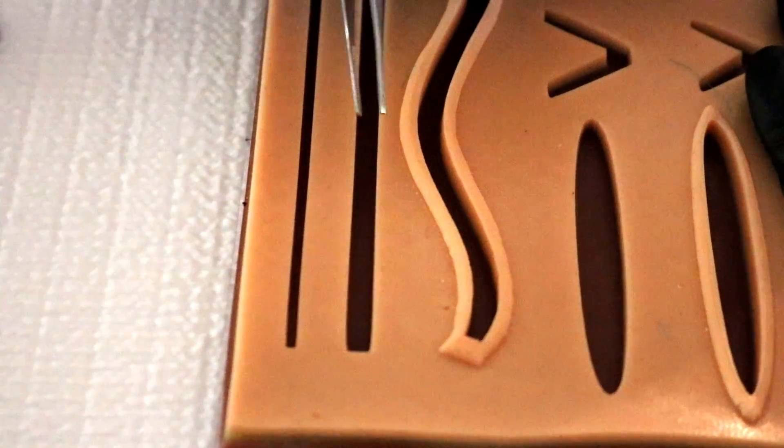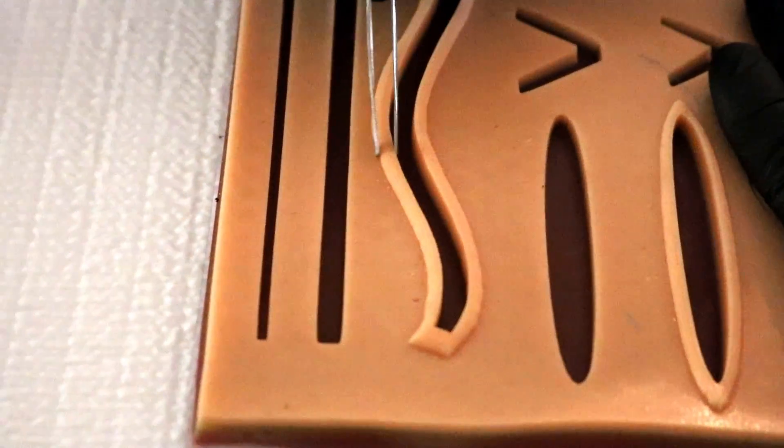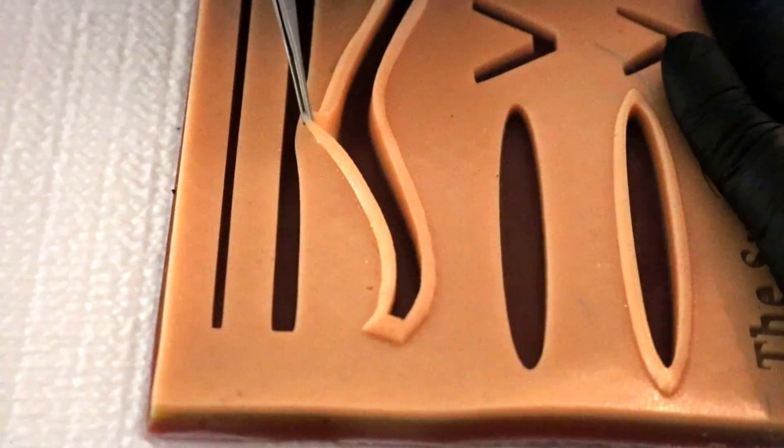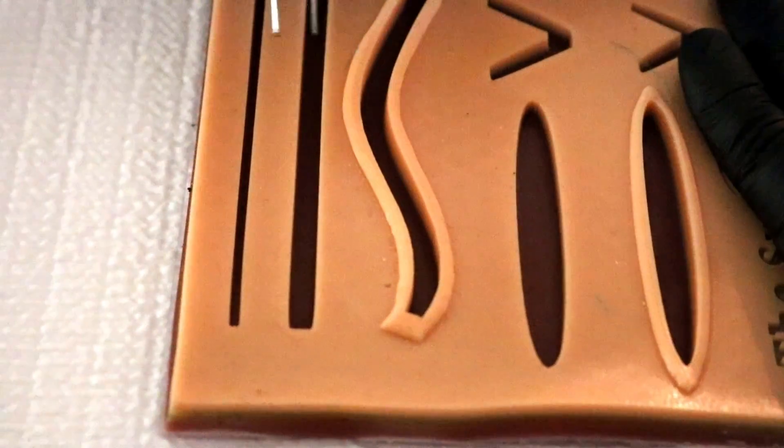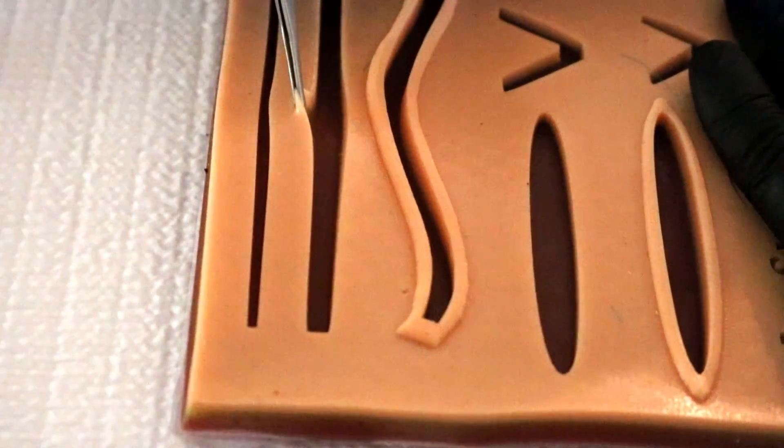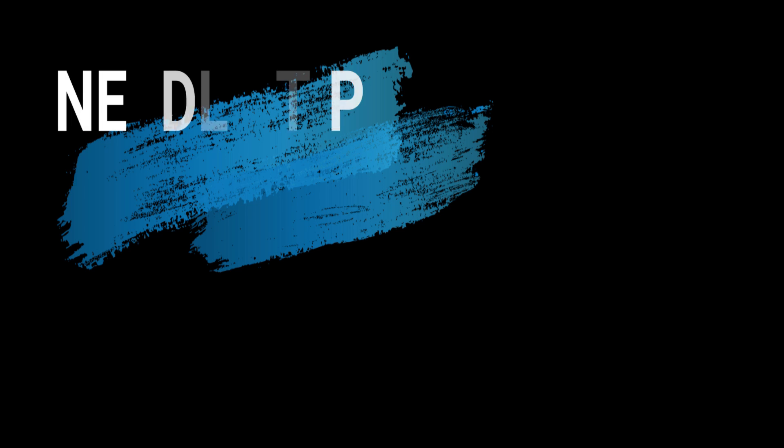You want to remember you want the inside of the wound to be touching. You want the edges of the wound to be everted not inverted so if you're gonna potentially invert that dead skin or dying skin at the end you're not gonna do any good for your patient.